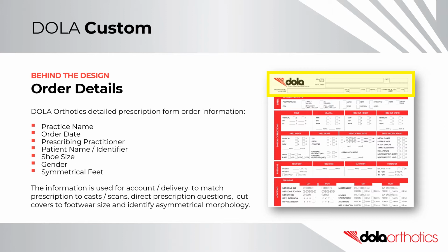Patient name or identifier allows the matching of prescription to cast, impression or scan. A patient identifier can be used to replace the patient name for confidentiality and may include initials, patient file number, or other code. Shoe size allows the cover length to be customized to the footwear to minimize in-clinic adjustment needed on dispense or incorrect cover length.